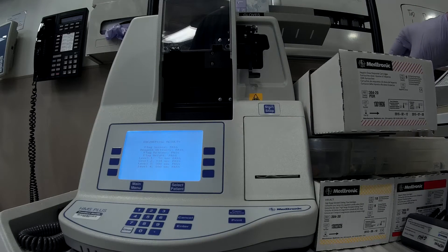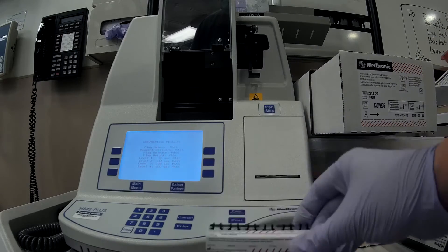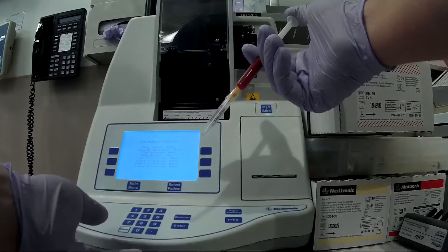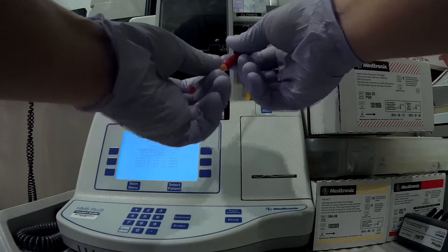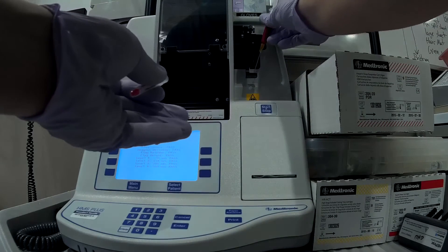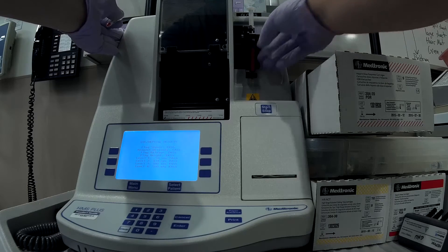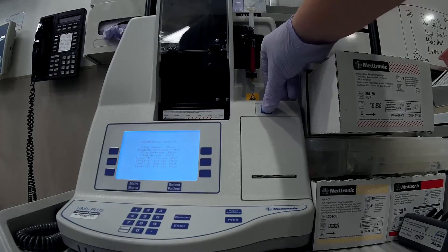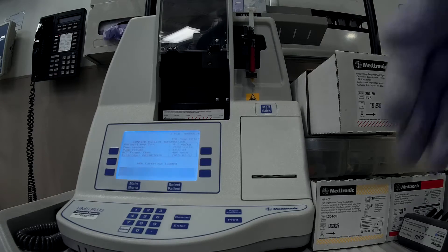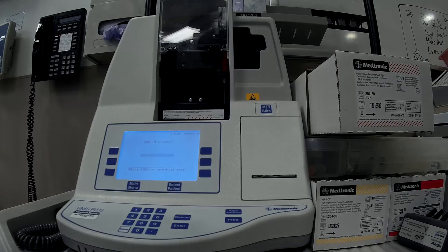Then select the heparin dose response, or HDR, cartridge and insert it into the machine. Expel a small amount of blood to remove any air. Remove the cap from the syringe and insert the syringe into the machine. Close the lever and press start, then press start a second time to continue. The machine will now begin to generate the HDR curve.